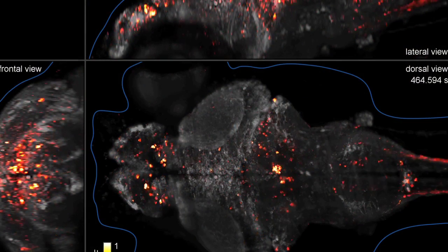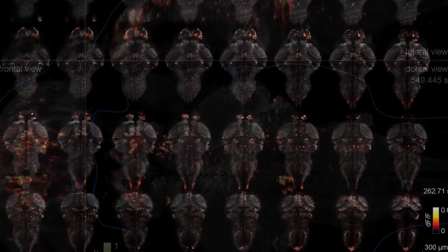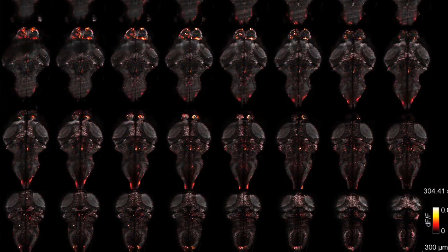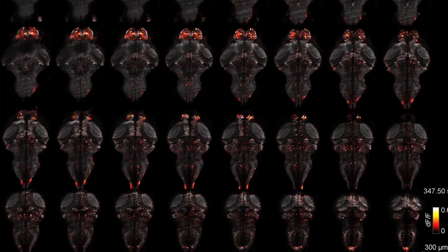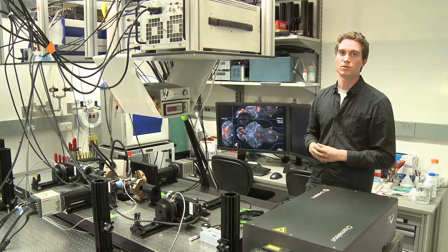So by quickly illuminating the sample with these laser sheets and then recording images, we can very rapidly image the entire brain. And this is in fact the first time that an entire vertebrate brain has been imaged at a speed that allows us to follow the neuronal activity basically in the majority of the neurons that the brain is composed of.